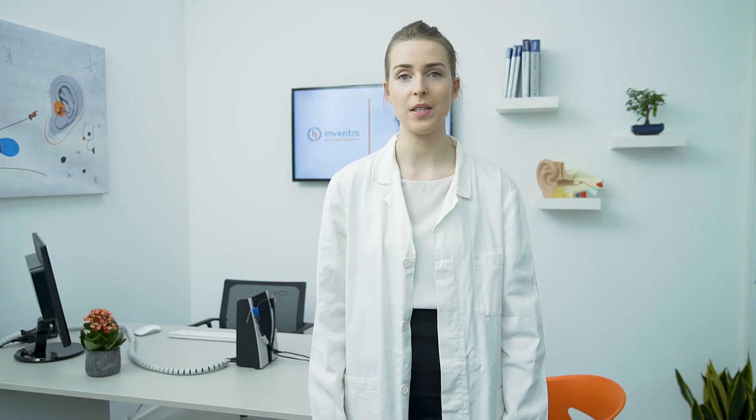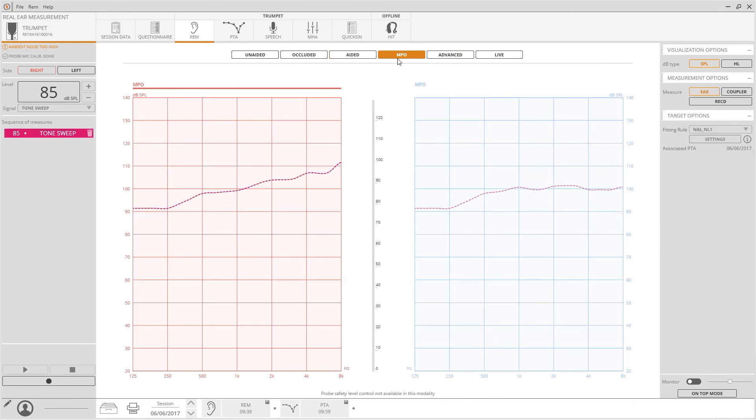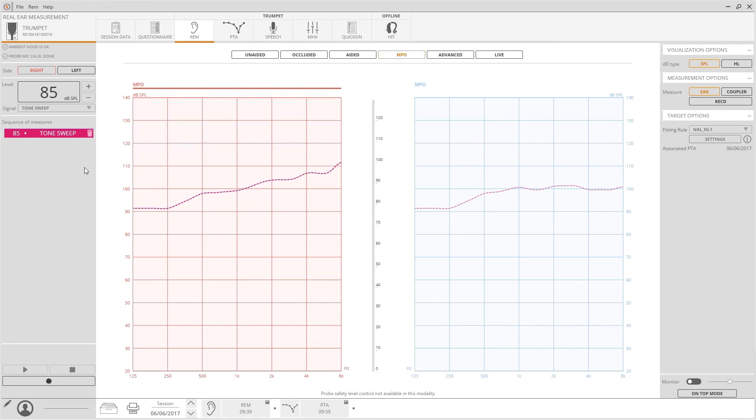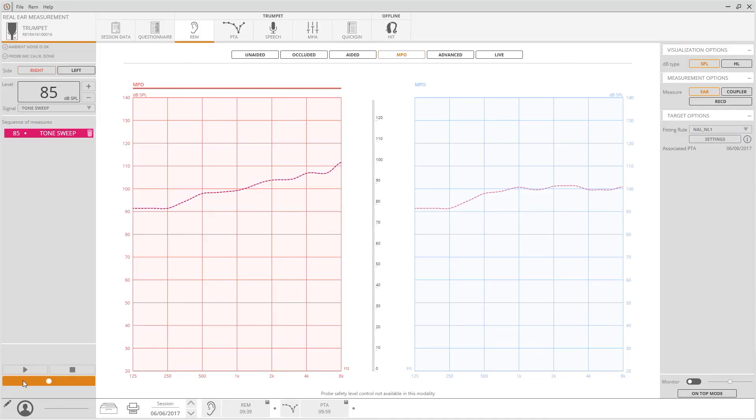MPO mode is dedicated to the maximum power output measurements. Considering the values of the previously matched PTA, the software calculates and shows the patient discomfort threshold as a dashed line. Then a tone sweep at 85 dB has to be reproduced so that it is possible to see if the hearing aid maximum amplification creates discomfort to the patient. The resulting curve should lay below the dashed line.